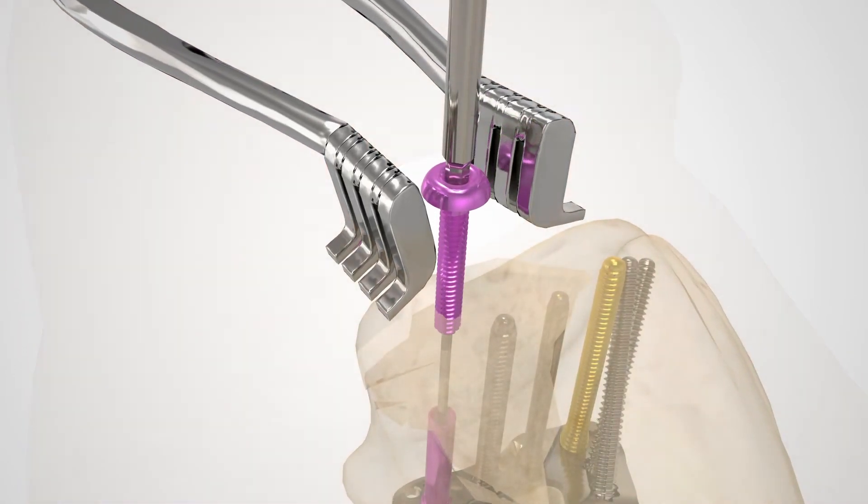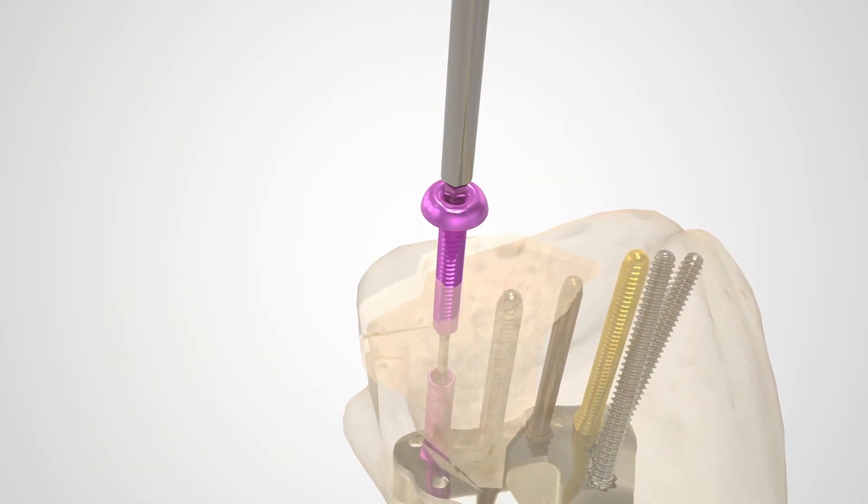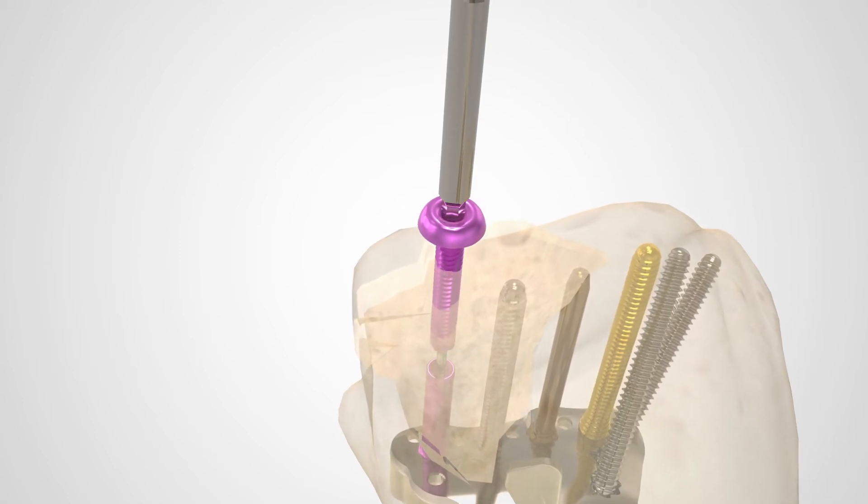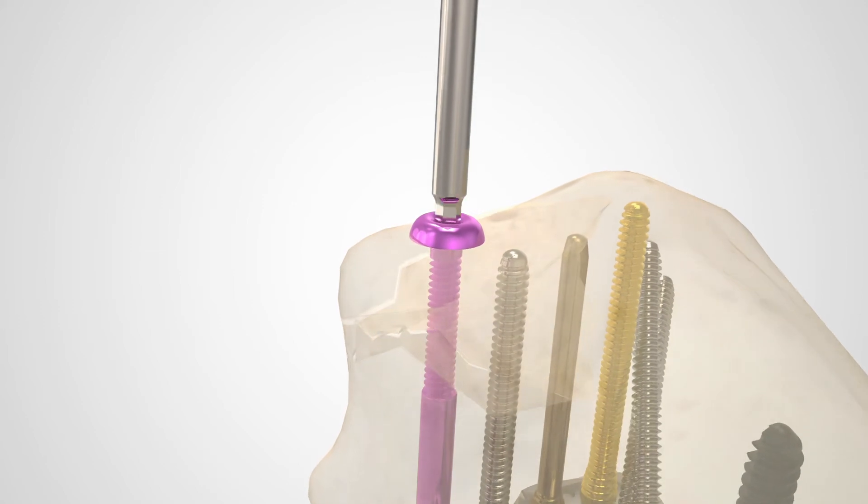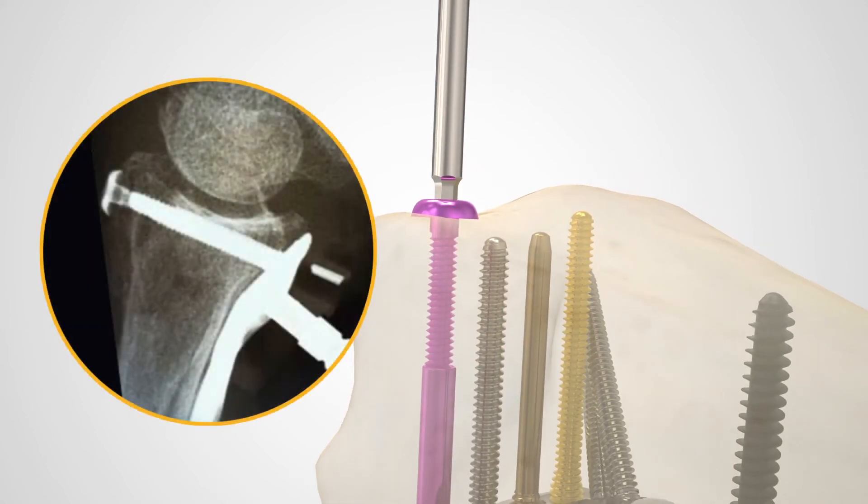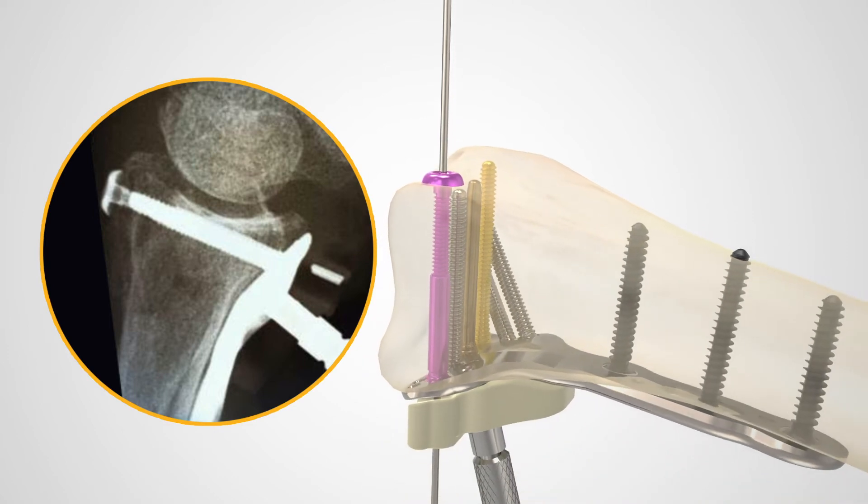Insert and tighten the FragLock compression screw until the desired compression is achieved. Ensure the FragLock compression screw head is fully seated on the bone and that the tendons are clear of the screw head. This should be done with fluoroscopic assistance to avoid over-compression of the dorsal cortex.